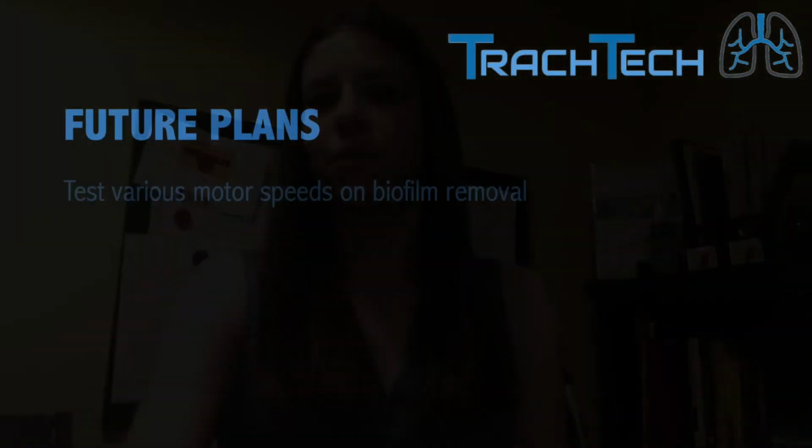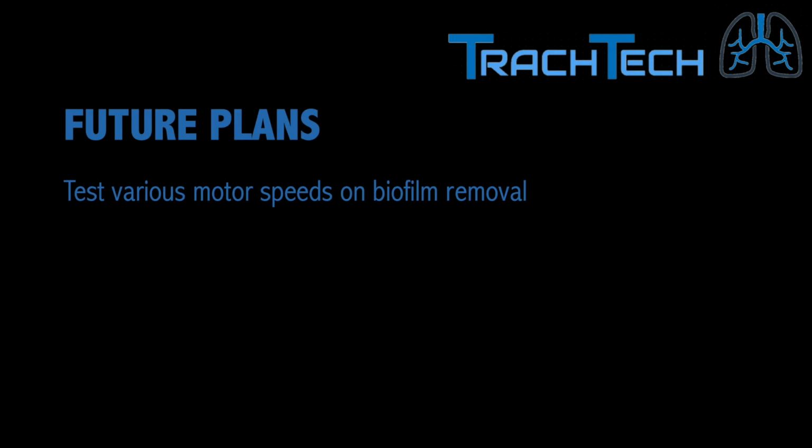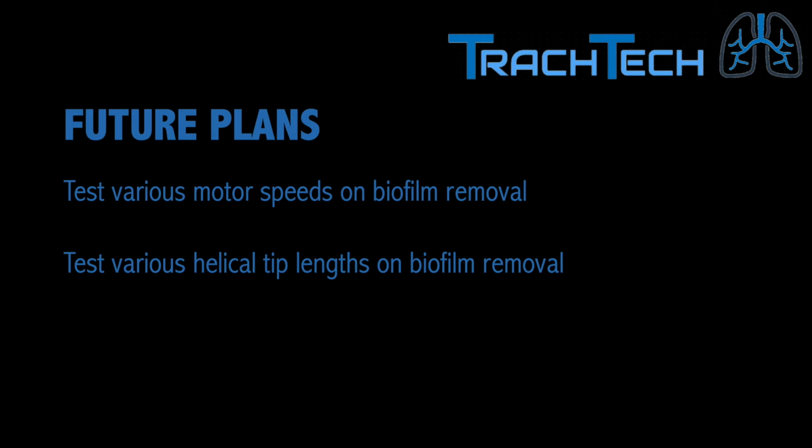Looking forward, we plan to expand on our current testing protocols. We hope to conduct more tests that will show us the most efficient way of removing biofilm. We plan to test if the speed of the motor will impact the removal of biofilm, in addition to testing variations of the tip length.